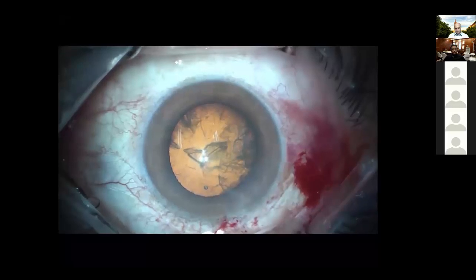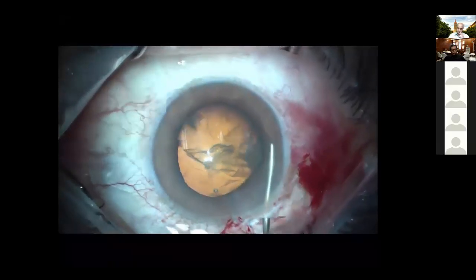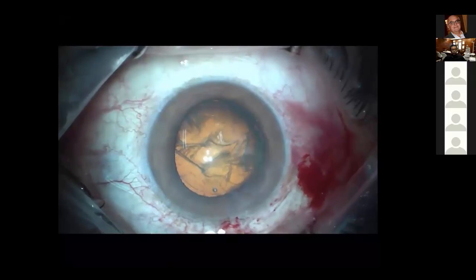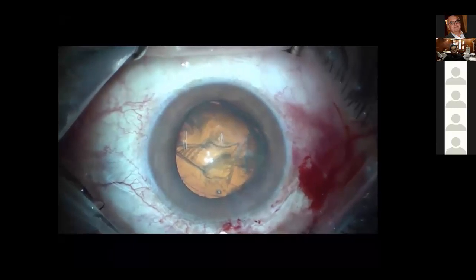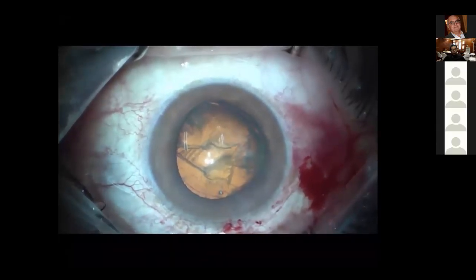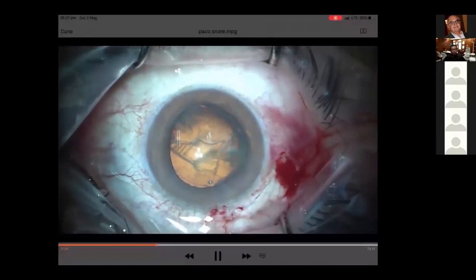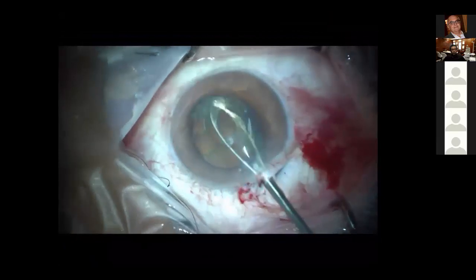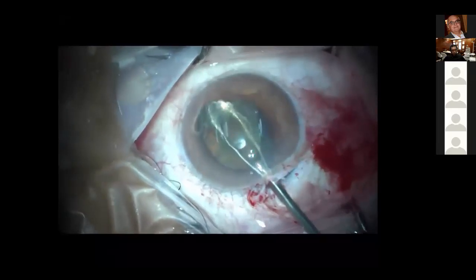and then you do a hydro dissection, which is important in order to expose the equator of the nucleus. It has to be enough to introduce the edge of the nucleus inside the anterior chamber to allow the phaco snare to engage the equator of this nucleus and be performed successfully. Now I'm going to introduce my phaco snare and then engage. You see, part of the snare is behind the nucleus and the other part is in front of the nucleus.